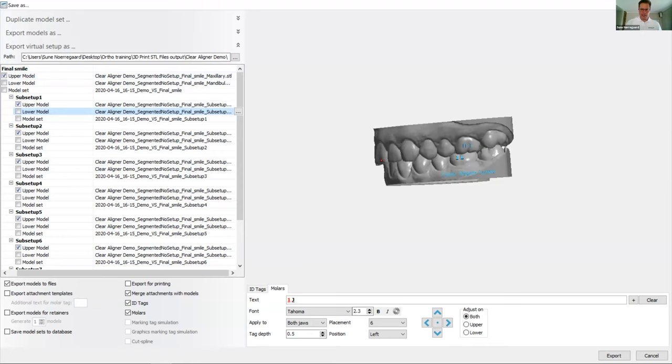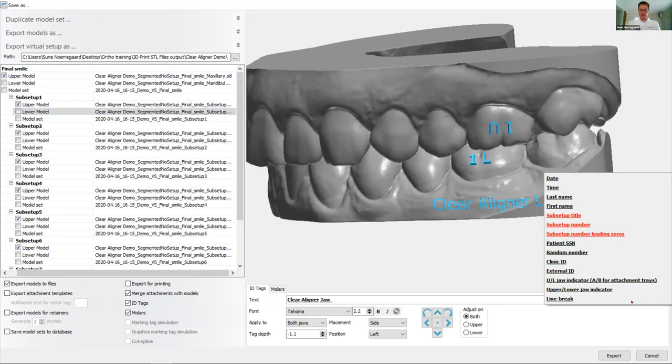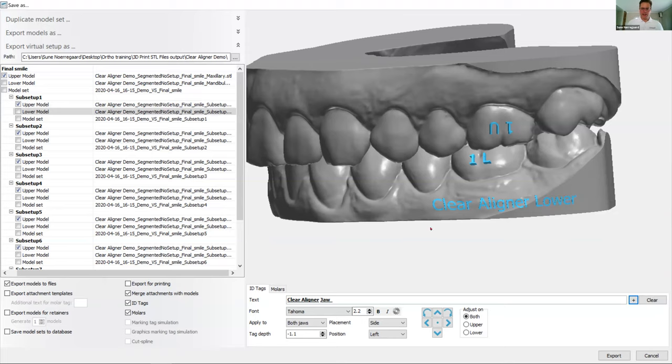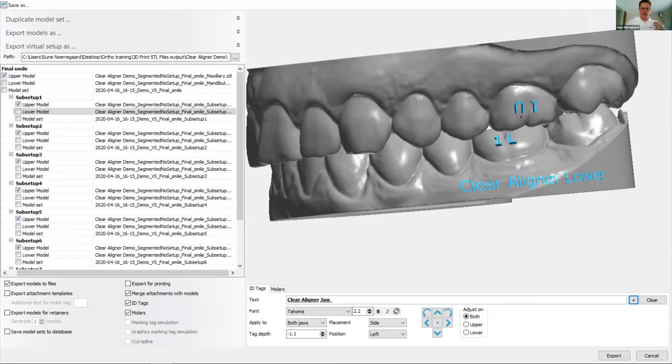Then we can choose to ID tag the model sets. And then we can choose what we actually want to include in our ID tag. So by clicking the plus here, I get a long list of different things that I can add to the model. Special numbers or clinic IDs, if I want to make sure that everybody knows, as it might go to a production person that doesn't know what's upper and lower, or the situation can be difficult to see. So you can add like, this is an upper model and this is a lower model and so on. So we can do quite a lot of ID tagging, and you can put the ID tag either on the side, you can also put it on the base of the model. And you can ID tag the molar so that the patient knows that this is the first aligner and this is for upper and the other one is for lower, so they don't mismatch them.